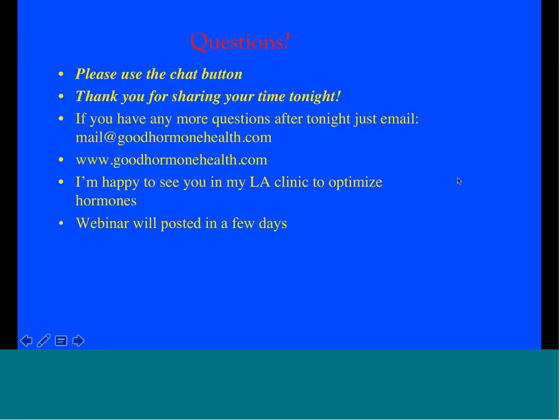Would this be a good device to use if you're passing STIM tests, but when you're under physical or mental stress with low cortisol symptoms, a good day to check what your cortisol is doing? Yes, I think it would be excellent for that, and you could then see that if you're on hydrocortisone, you need more that day. Because it's not FDA approved, I don't think you can take it to a doctor and say, I need to go on hydrocortisone because of this. But in the future, this is definitely the wave of the future. Other labs are going to be doing this, and I think this is going to advance the field.